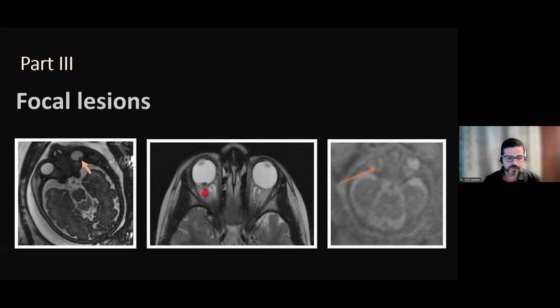My final part here is the focal lesions, and I would like to show you three different examples. Once again, these are focal lesions where everything else looks okay, but there is a problem there. And this is a very beautiful image from Camilo's group, who I think at the moment is busy working. It's very hard to give a differential instantly when you see a focal lesion like that, but the contrast which is intrinsic to the eyeball there would tell you that there is a problem, and the context becomes important.